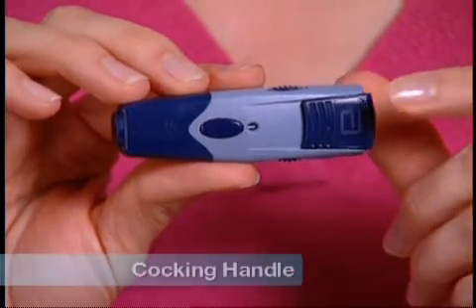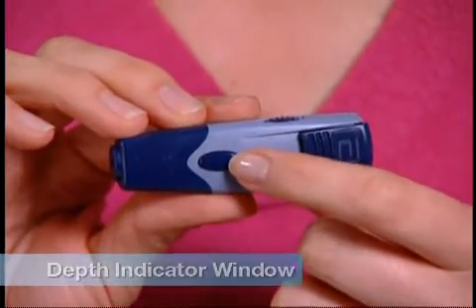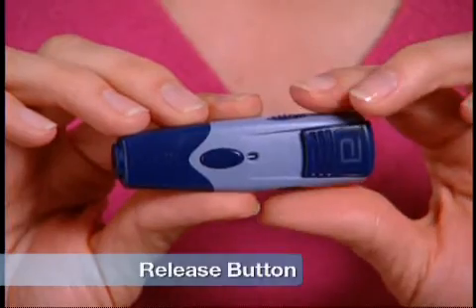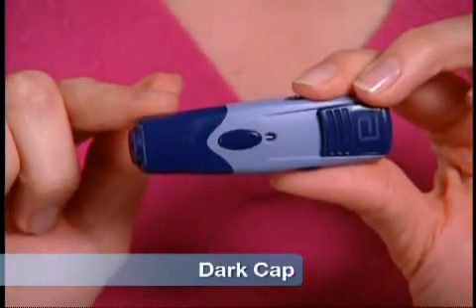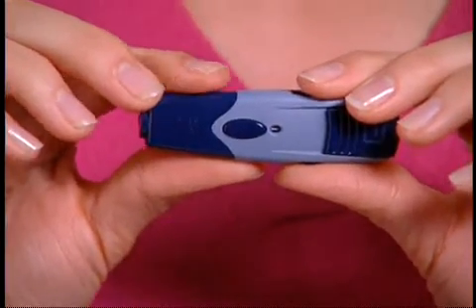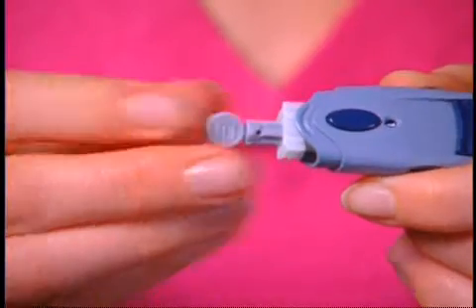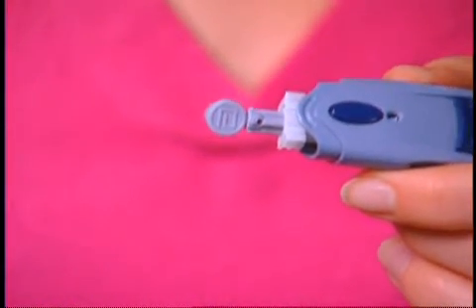The Lancing Device has a cocking handle, depth setting dial, depth indicator window, and release button. The device comes with two caps — a dark cap for finger testing, and a clear cap for testing sites other than fingers. If you're testing for hypoglycemia, low blood glucose, or you suffer from hypoglycemia unawareness, we recommend that you test on your fingers. To load the Lancing Device, snap off the cap at an angle. Now insert a new FreeStyle Lancet firmly into the white Lancet Holder Cup. Pushing the lancet into the cup may cock the device, and this is all right.